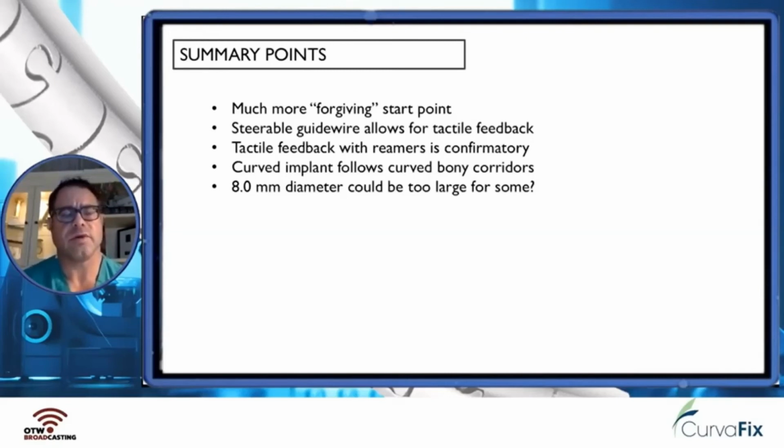And as I've done some posterior pelvic ring cases, I've experimented with different start points that will allow the implant to actually curve more, as obviously we don't need to be straight on our pathway with this implant, and having it curve and stuff these osseous pathways and then become fixed, rigid, and locked is going to provide even more stability and fixation and holding power.